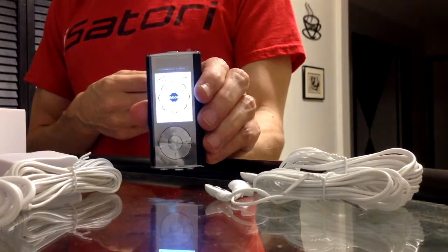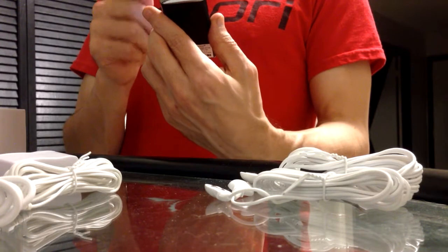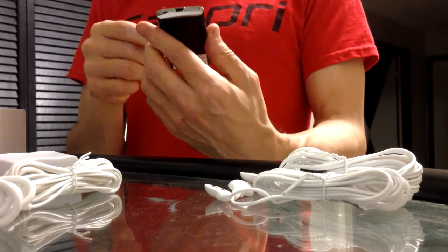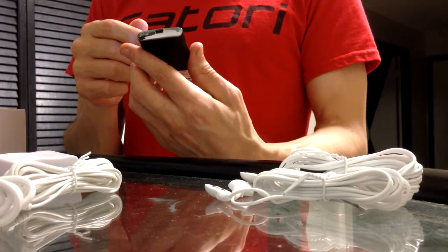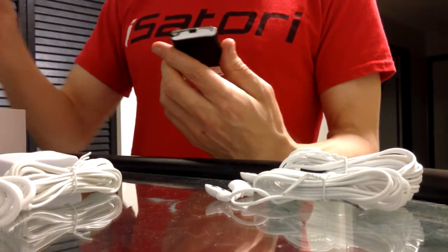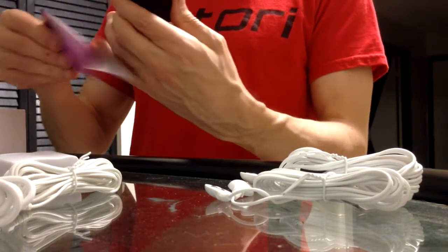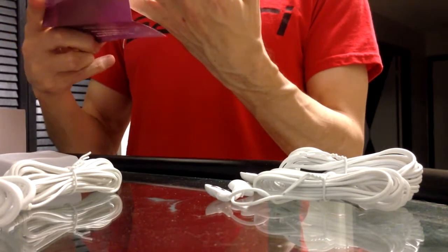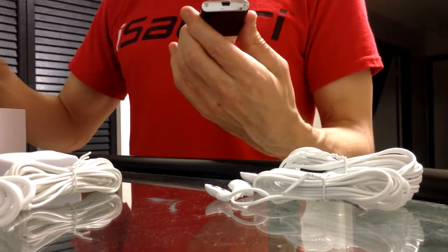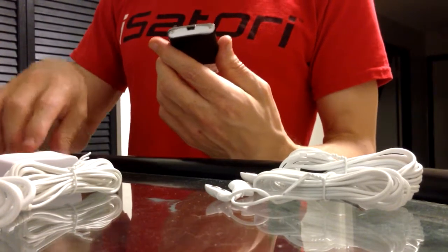There's the screen — it instantly powers up. It has eight separate settings. Oh, it comes fully charged by the way. I'm sure in the book they will tell me which ones I want to use. I believe I want to use the acupuncture setting.